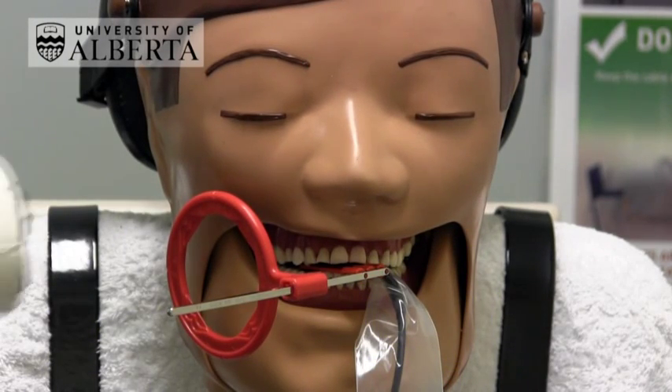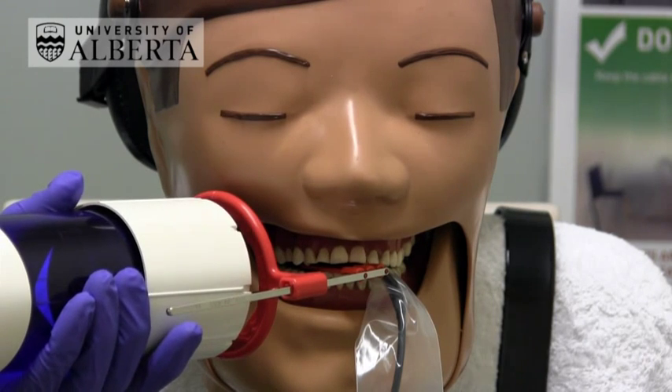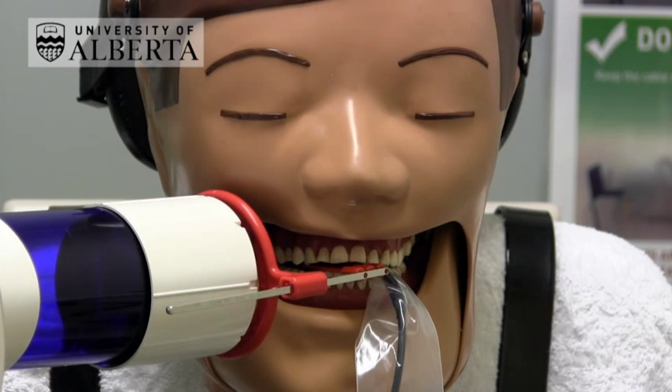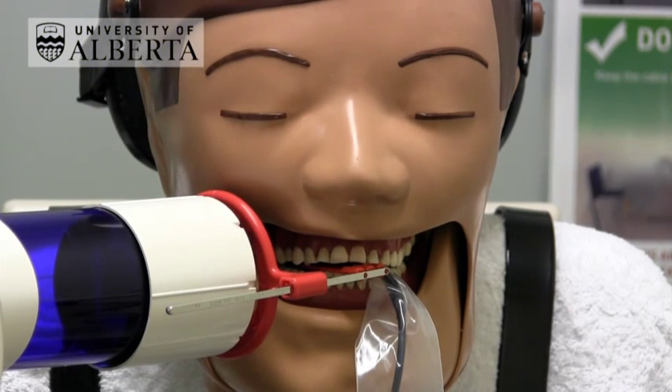For this view, we do not line the collimator directly with the ring. If we do it like this, we will get overlapping of the contacts due to the angle of the receptor in the patient's mouth.